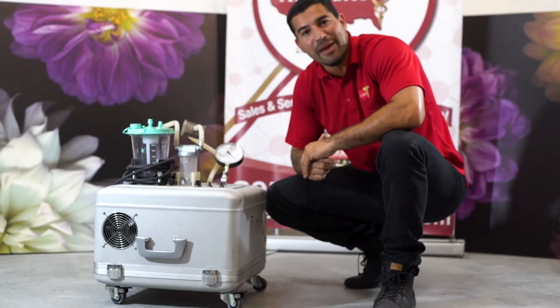Hey guys, Victor here with Allstates Med, and next to me I have the Hercules Liposuction Aspirator. This is one of our top-of-the-line liposuction aspirators.